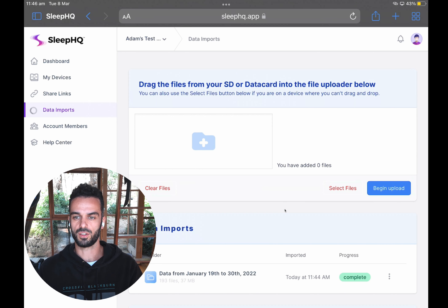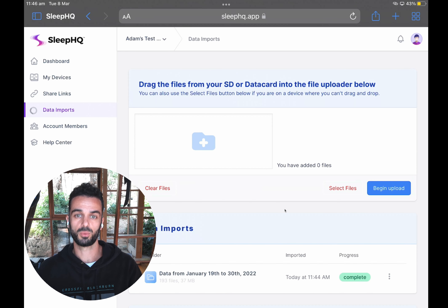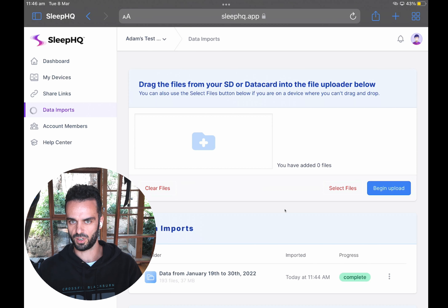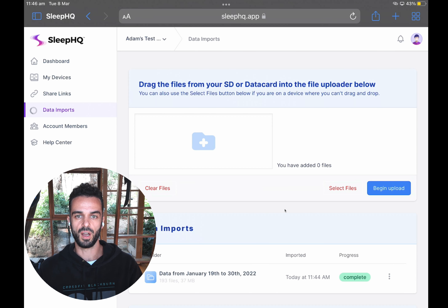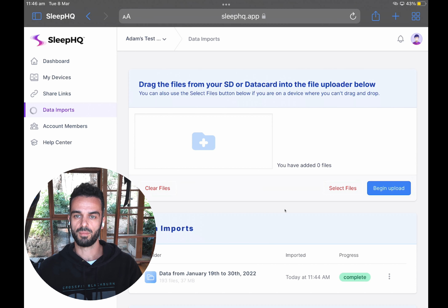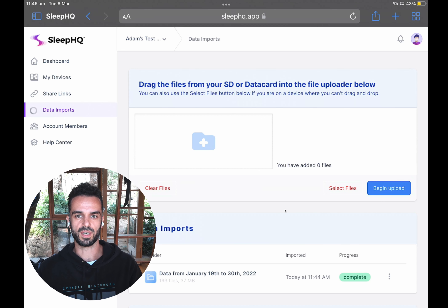That's basically it for importing your data on a touch device. Whether you can click and drag multiple files or you're on an iPhone where you can only select a single file at a time, those two methods will get you there. As always, if you have any issues make sure you let us know and we'll do everything we can to help you get all your data imported successfully. Thanks guys, I hope that's helped!